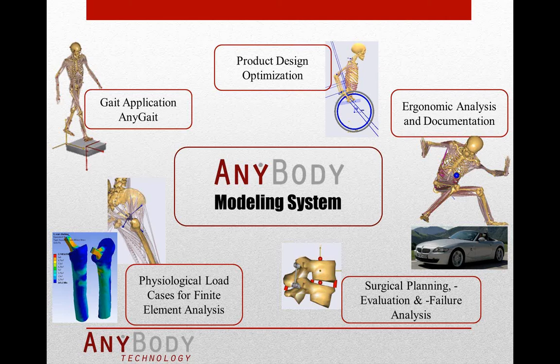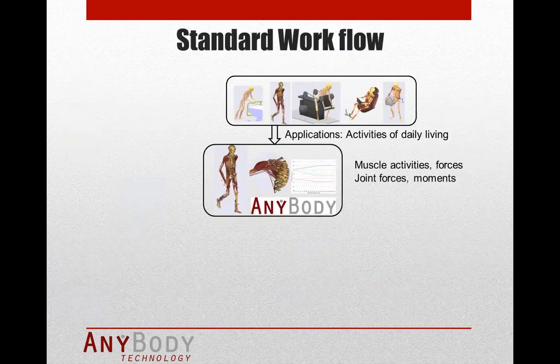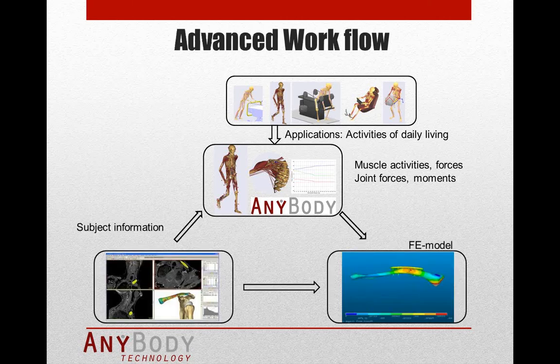You can do surgical planning, evaluation, and failure analysis. This is more related to what we hear later on from Michael. Then you can export physiological load cases into finite element analysis, and you can also process gait trials in the gait application called AnyGait. So typically you would have an application like an activity of daily living and analyze that in AnyBody to compute muscle activities, forces, or joint forces and moments.